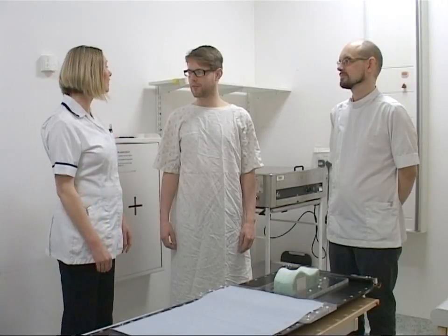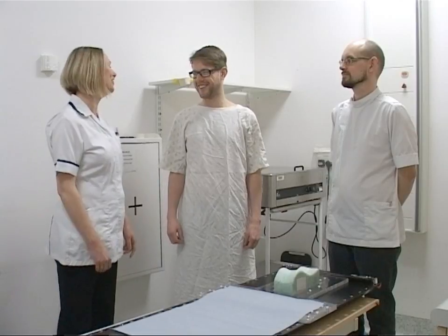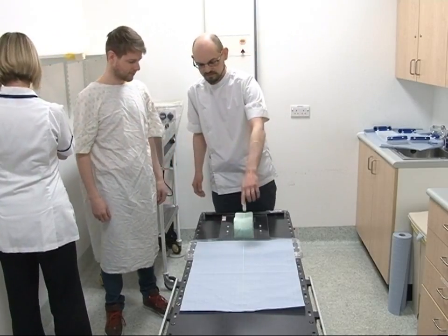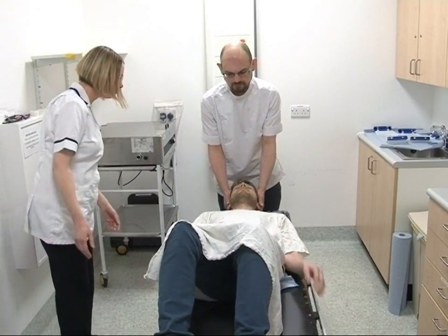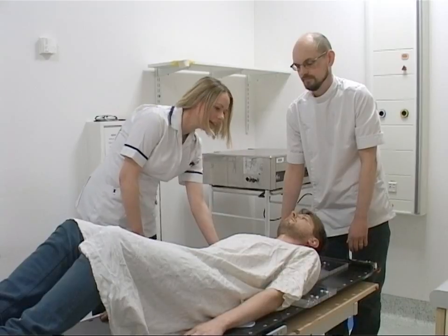We will need you to take your glasses off and ask whether you have any dentures. If you just want to take a seat and lie down with your head on the headrest. For men, if you have a beard, it is a good idea to shave it or trim it closely. The table will be raised up a little.